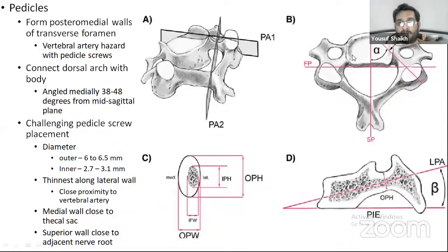So I'm not saying that the pedicle screws cannot be placed. Yes, the pedicle screws can be placed if you are a very experienced surgeon or you have neuronavigation, but they do not offer any significant advantage, and such a risk is not worth it. Better purchase and better stability can be achieved with lateral mass screws. So we have an alternative.